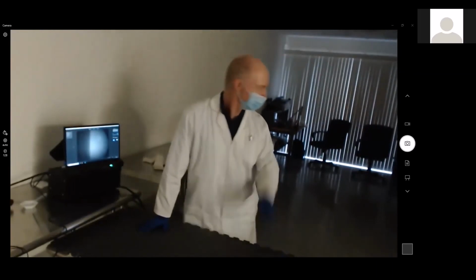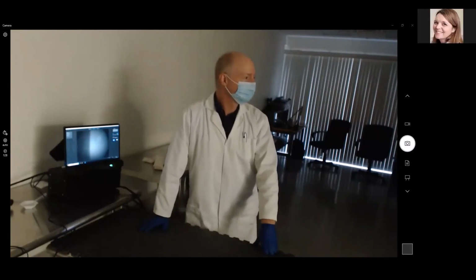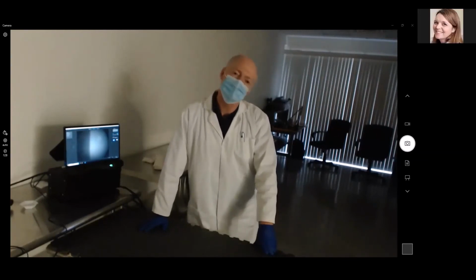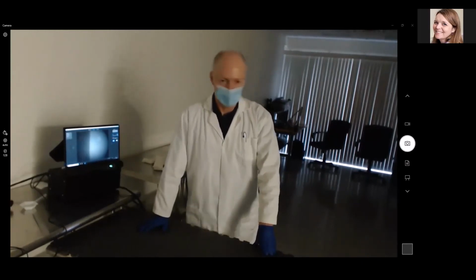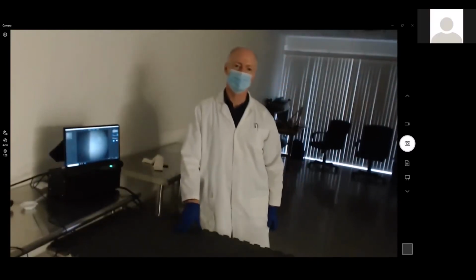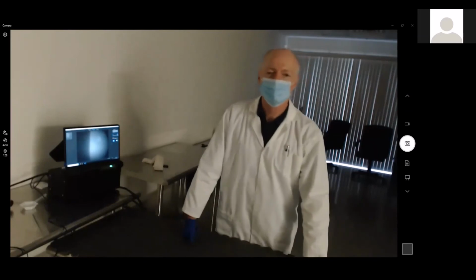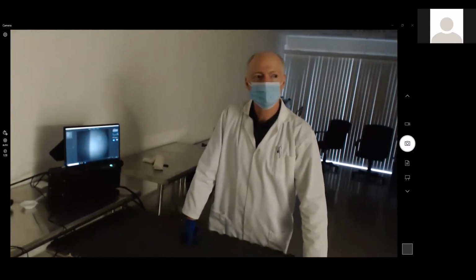Jeremy said he has a specific question about our fundoscope system. Yeah, so Jeremy had a question about your fundoscope system. But I think the rodent one. Correct. Specifically, in the system itself, I've been working with it for a bit, and I noticed a few things. First, when you go under measurements, it doesn't give you any units it's measuring by. So I was wondering, what is that supposed to read?